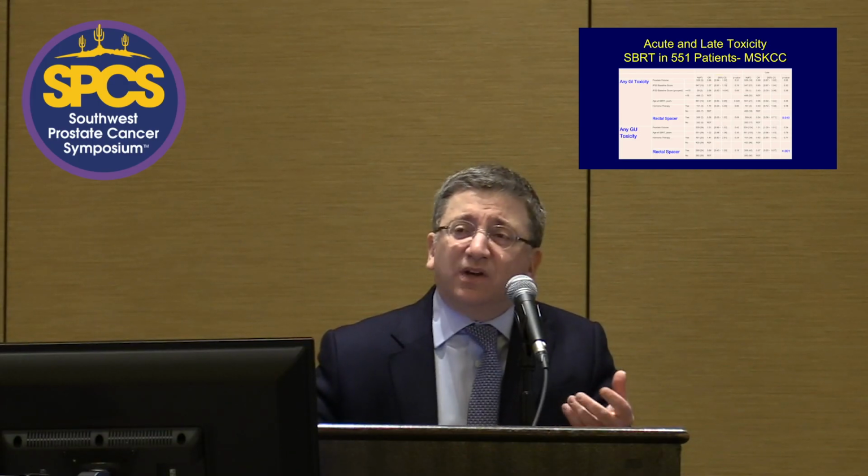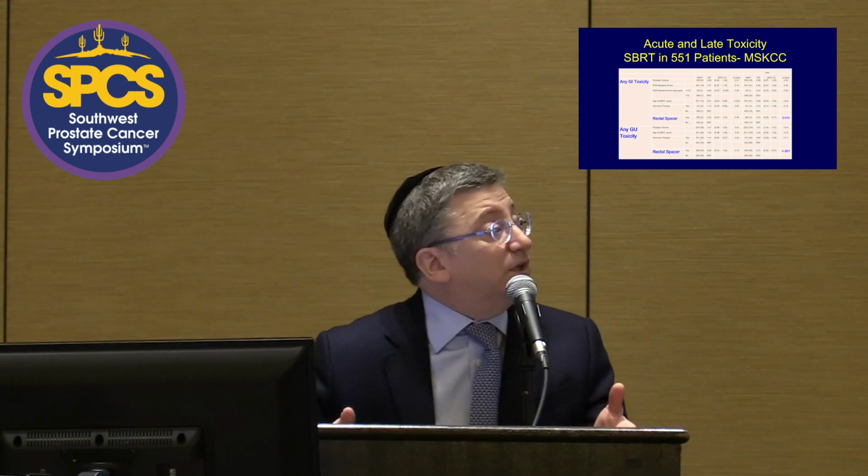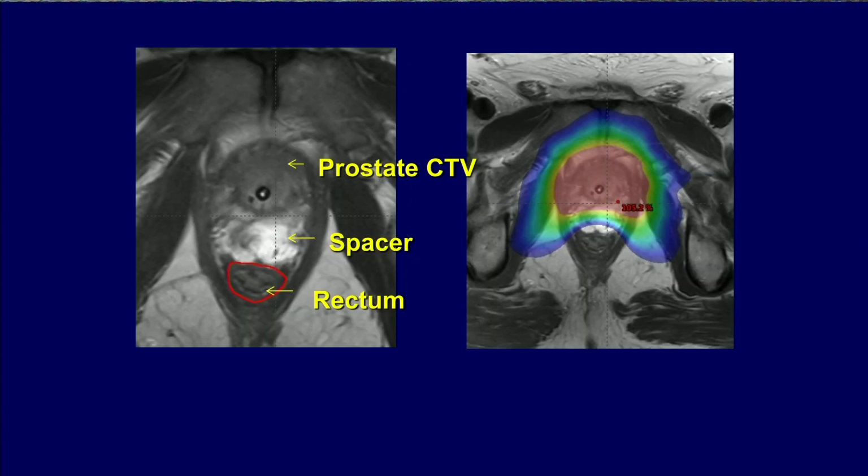Is it possible that we are seeing, as a result of the placement, less dose to the urethra, or less dose perhaps to the bladder neck trigone region? And so we are looking at that right now and trying to analyze. But it appears that from a number of publications, there may be some benefit for even reduced urinary toxicity. And Hamstra also had reported the reduction of sexual-related dysfunction among those patients who have had the hydrogel spacer, suggesting possibly lower penile bulb doses, but I think this has to be validated also in future trials.